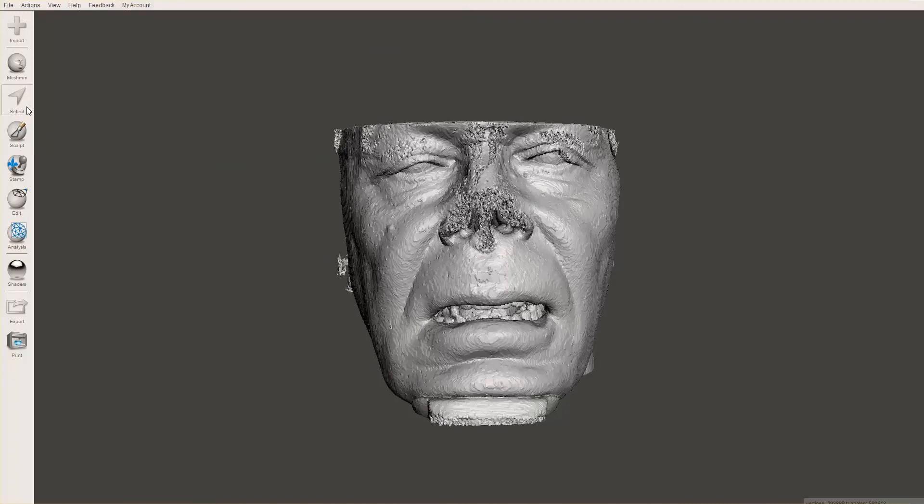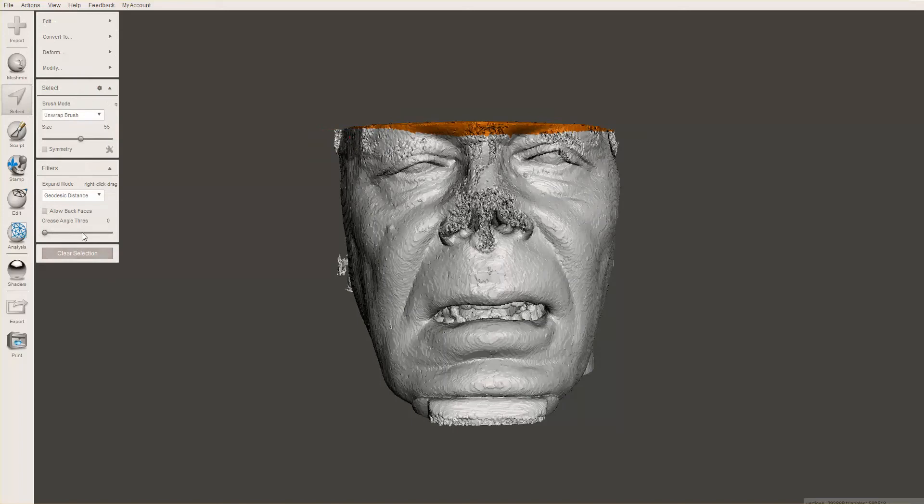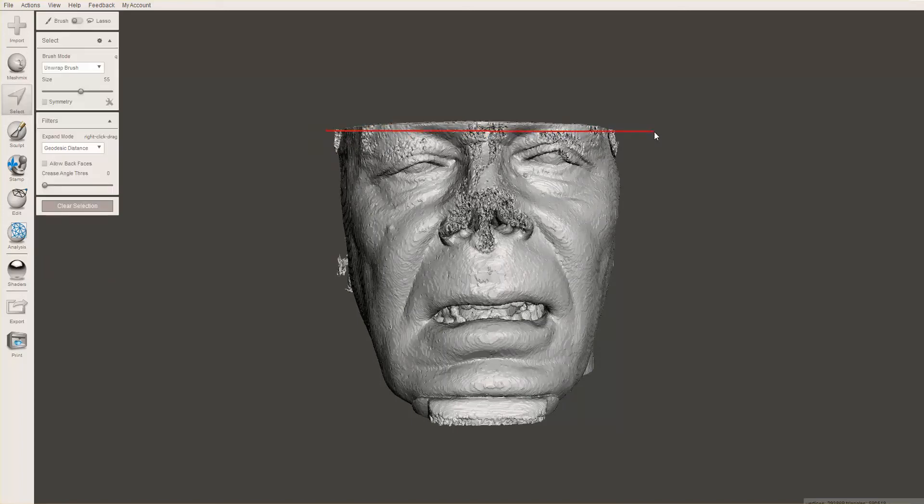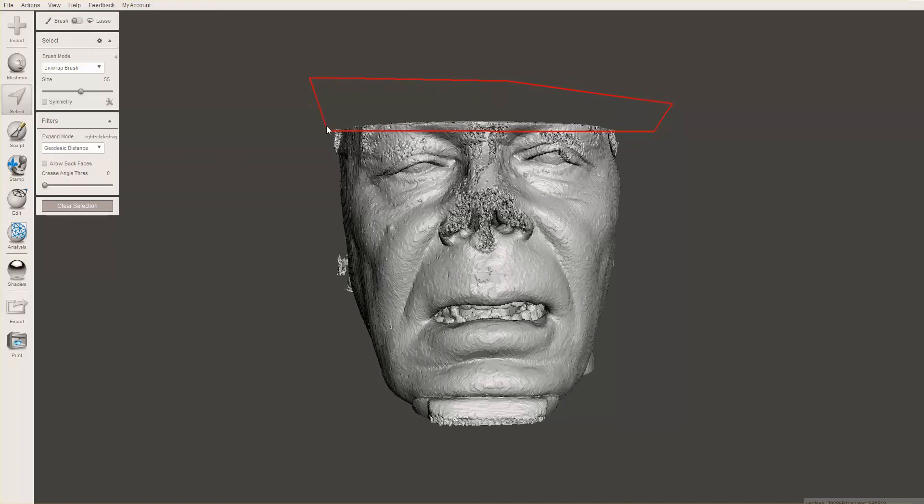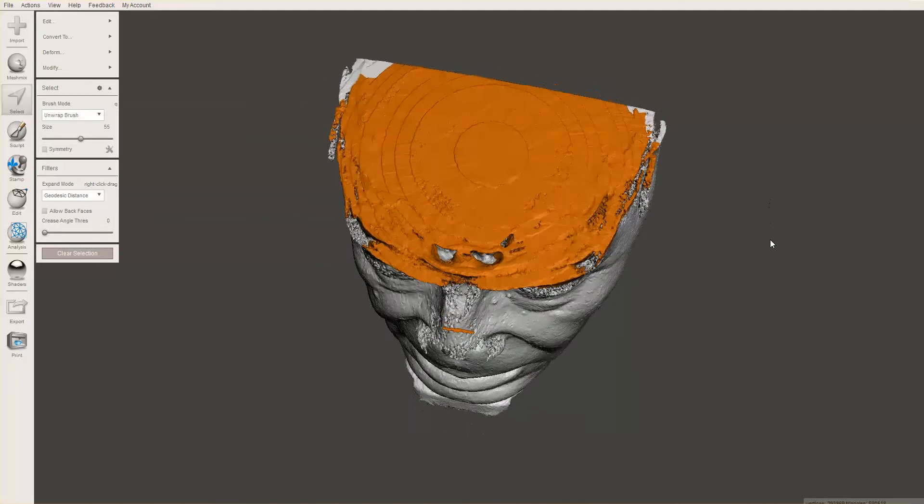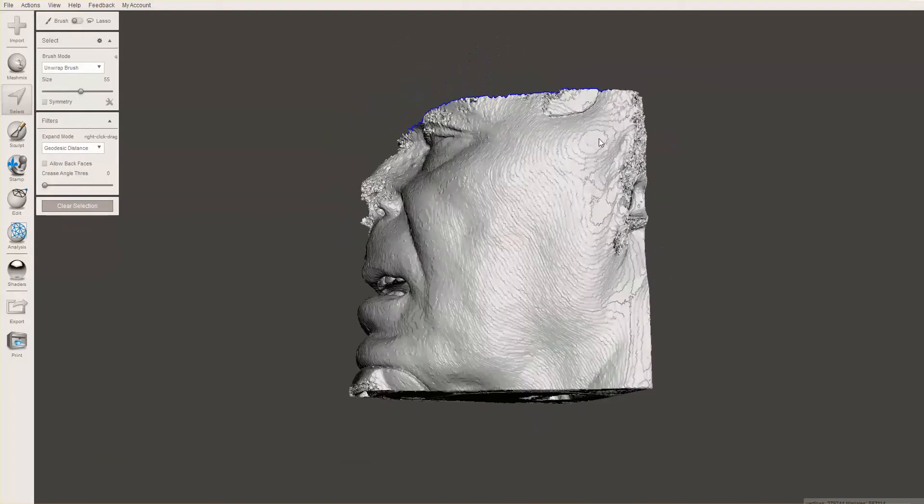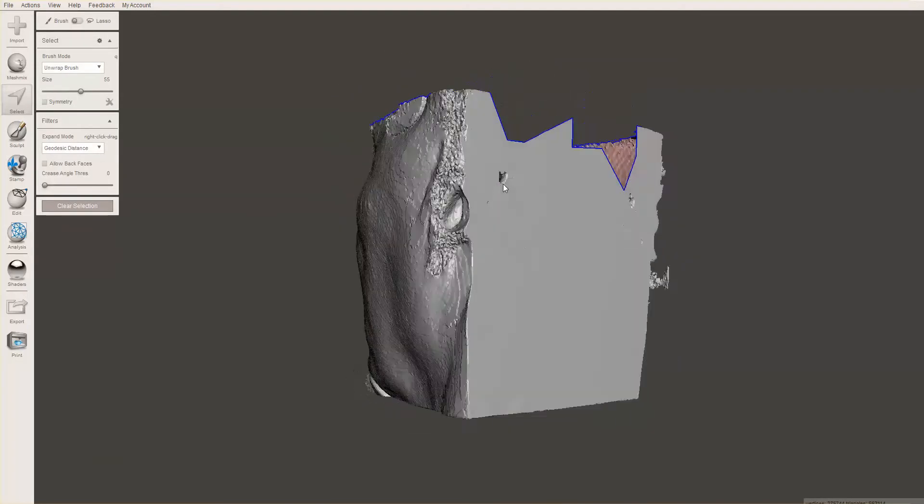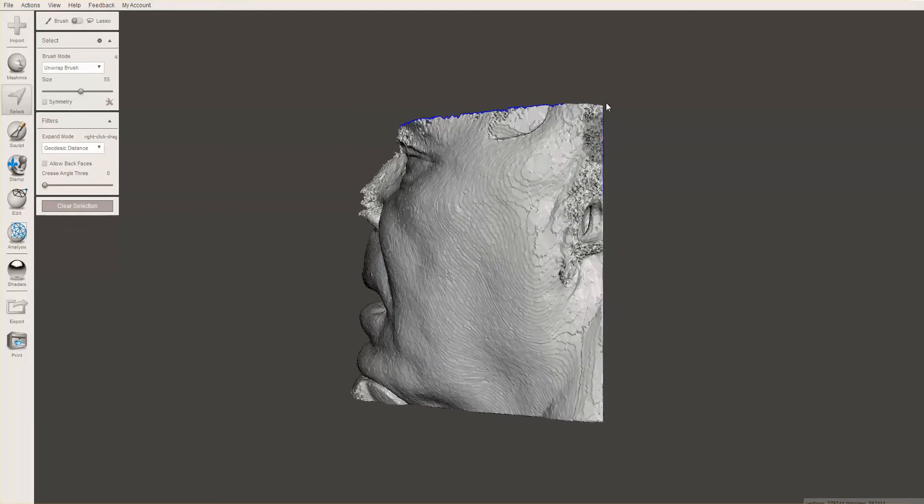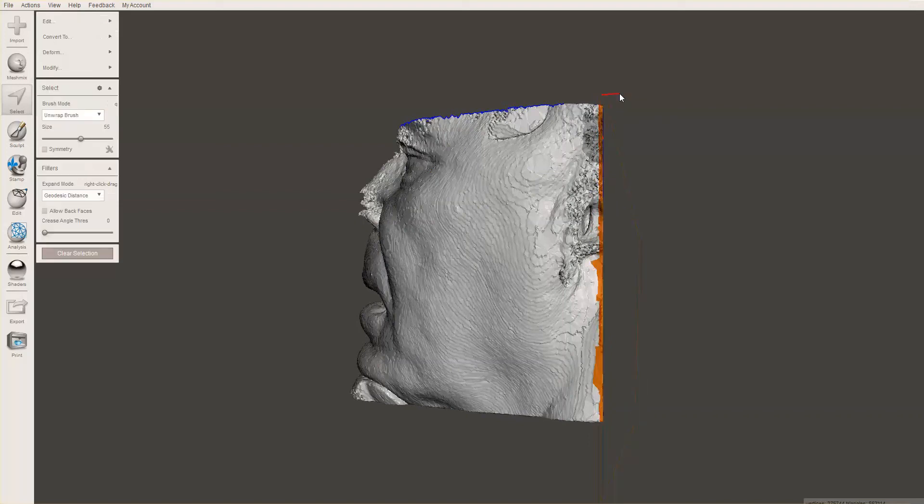So we're going to do a little surgery on this patient's head. And actually, let me redo that. Select. I'm going to do a single click here. And just more or less use this like a plain cut. And then circle it back. And you'll see that it selects the very top of the head right there. So I'm going to push delete. All right, we got that. We need to do that now with the back. So I will select. And delete.